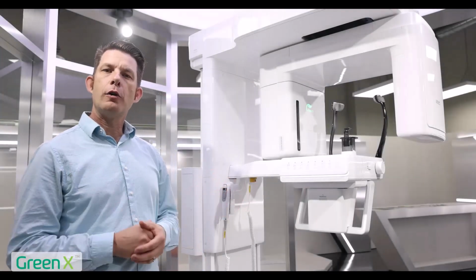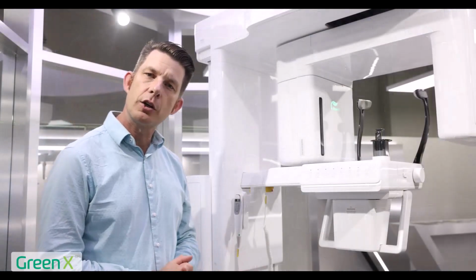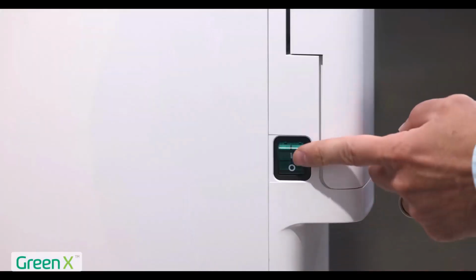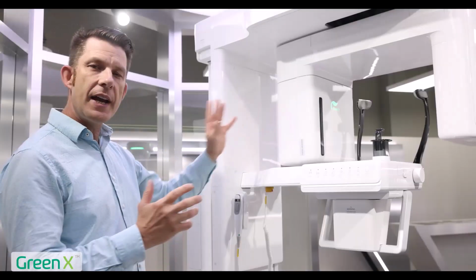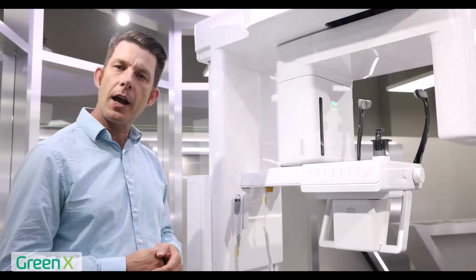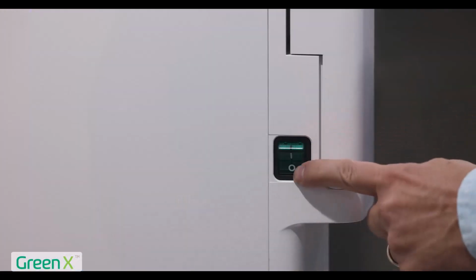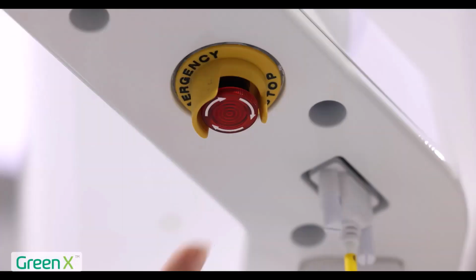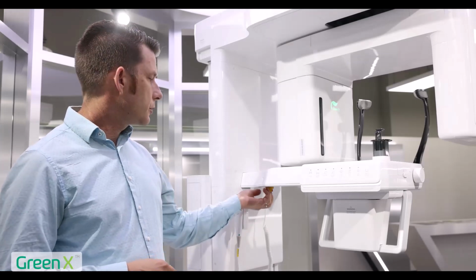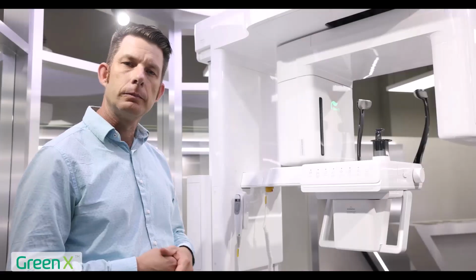This will be an overview of your Green X device. First, let's talk about the on-off switch. It's a green toggle, which is located on the back of the device. You want to go ahead and turn that on in the morning. The device will rotate and go through some checks. In the evening, you want to go ahead and turn the machine off. Under the horizontal column, there's a red button. It's the emergency stop switch. If that is depressed, it will illuminate red. Turn that counterclockwise to turn the device back on.